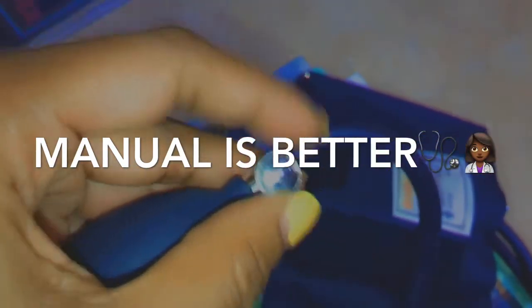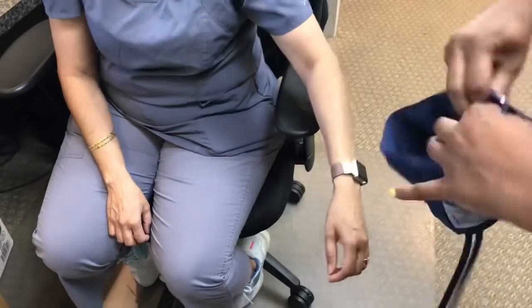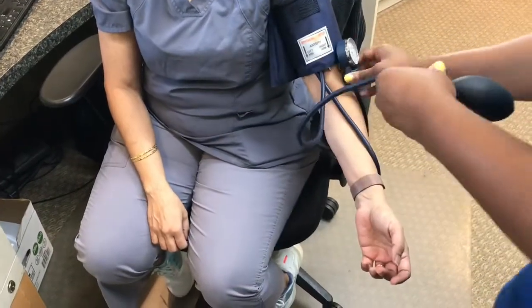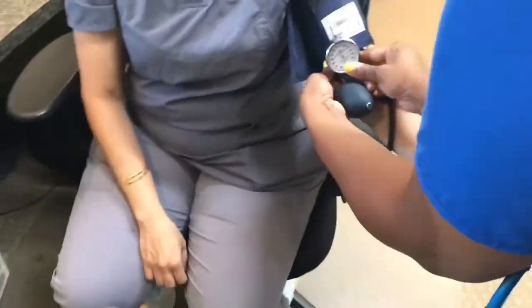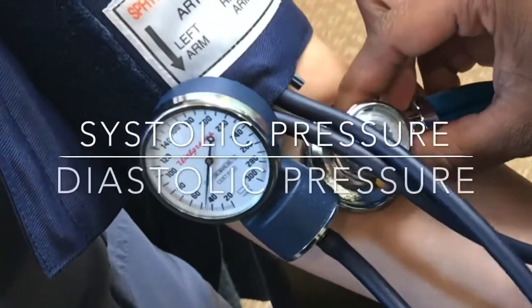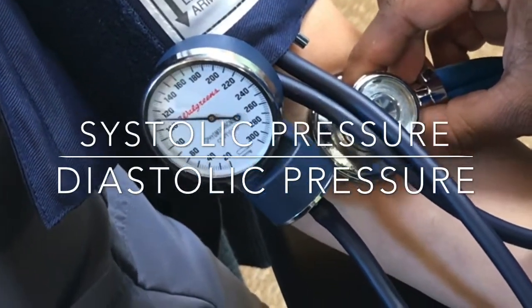This is how you release it. You're going to start off by putting the cuff on the arm. Make sure you wrap around tightly. Sometimes I like to make sure I put the meter where I can be able to see it, and then you're just going to go ahead and pump. I usually pump all the way to 140, between 120 to 140. Once you hit the first beep, then you slowly release.